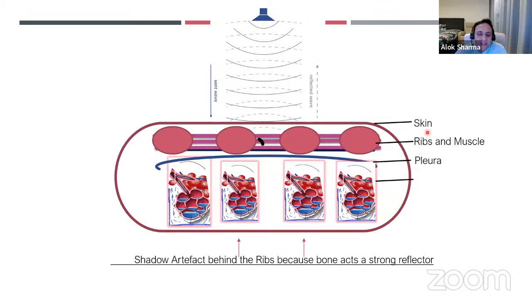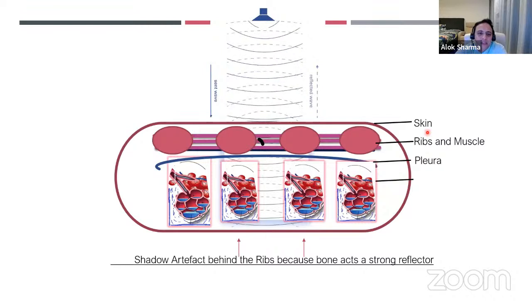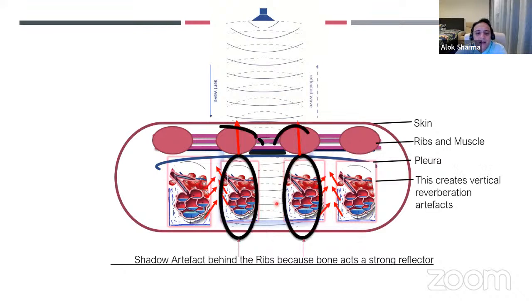So how does this manifest and how does this happen? Classically, you can see sound waves coming through over here, and the rib shadows coming in the way, reflecting sound waves back. The rib shadows reflecting sound waves back mean these areas of the lung can't be seen, and that creates your acoustic shadow. But this area of the lung, which has tissue in it, will be seen. These acoustic shadows create dark areas, whereas this tissue creates the ability to see lung. You will see the pleural margin with these ribs seen as this. And this is classically what we call the bat wing appearance of normal lung.